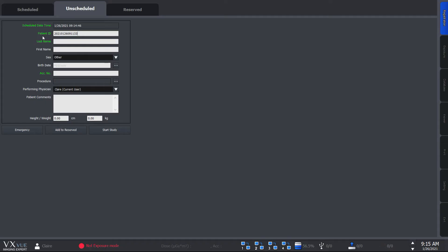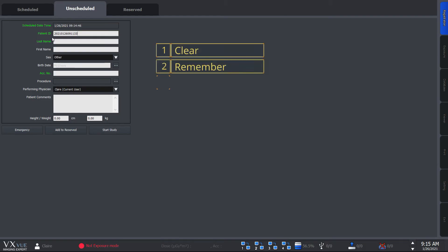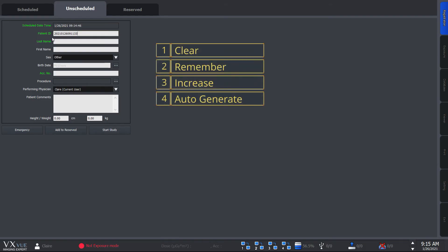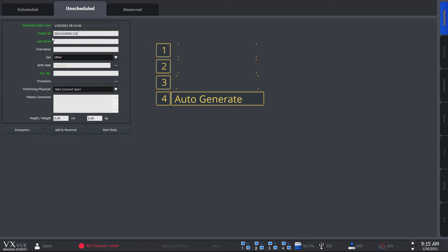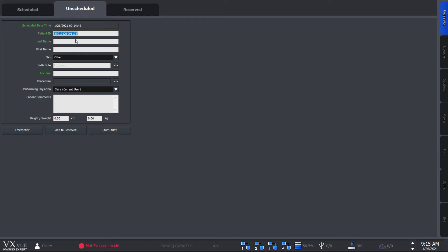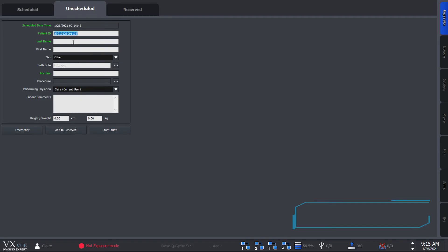You can select how to manage the patient ID in setting. There are a few managing options which are clear, remember, increase, and auto-generate. It's currently set as auto-generate in this video which means a random ID is automatically generated as you can see from here. You can learn more about the options from our service manual.